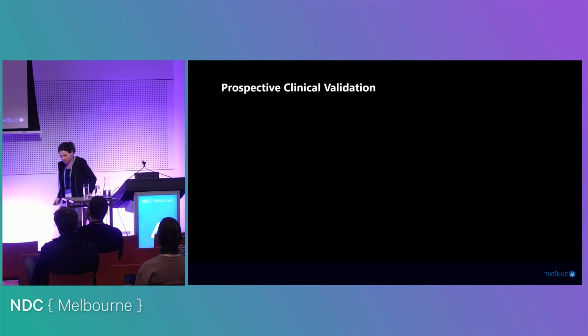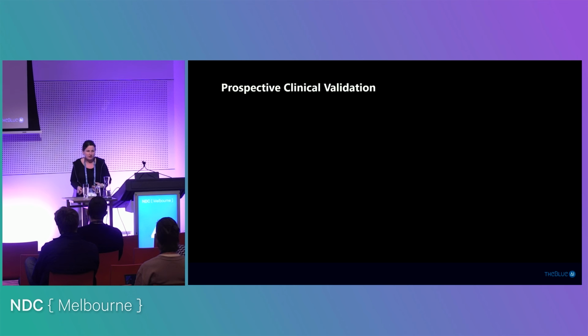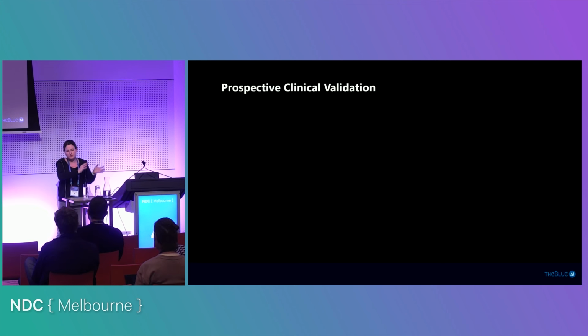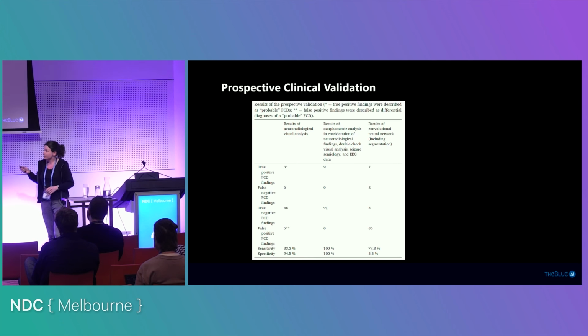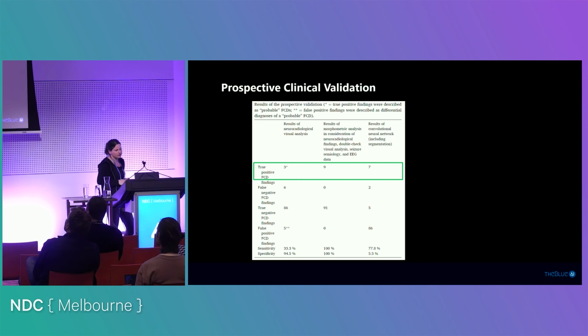So we are quite happy with our results, and we decided to do a clinical study, because you usually do that before you start using it in medical practice. We took all of the patients that were in the epilepsy center, and apart from the normal standard diagnosis, we also checked them with our model. And these are the results. I will again highlight the relevant pieces. So let's take a look here at the first row.